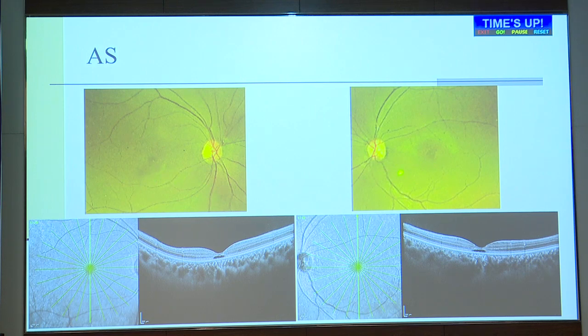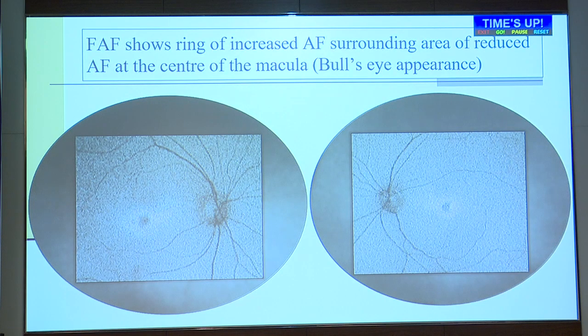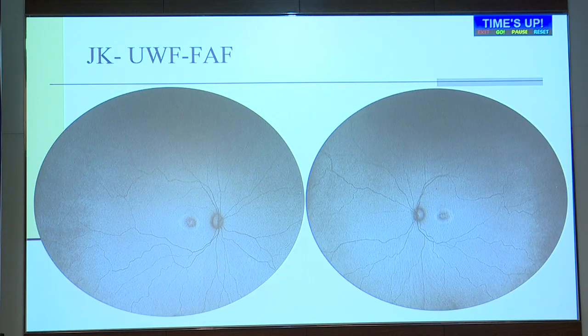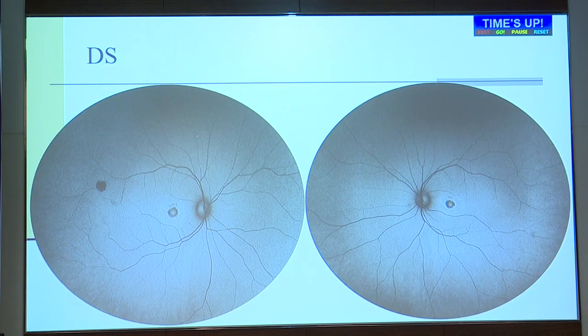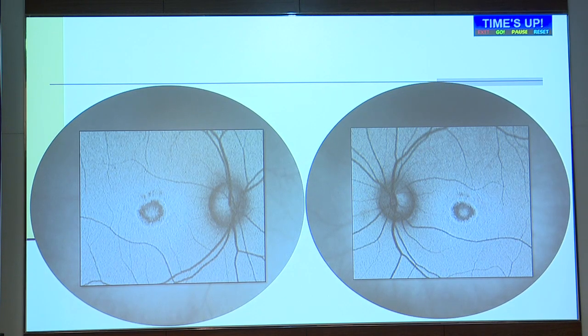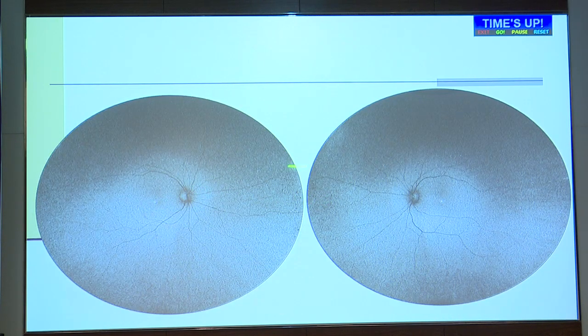It's a patient, a 28-year-old lady, who complained of decrease in color vision and day blindness kind of thing. And this was the OCT image. And the ultrawide field showed us a bullseye maculopathy, suggestive of cone dystrophy. Some other patients of bullseye maculopathy. And very often you see patients with nearly normal looking maculas, where you can pick up these lesions. There's another patient where you can see that the fundus looks nearly normal, but you can see a hyperautofluorescent area here, indicating a maculopathy.